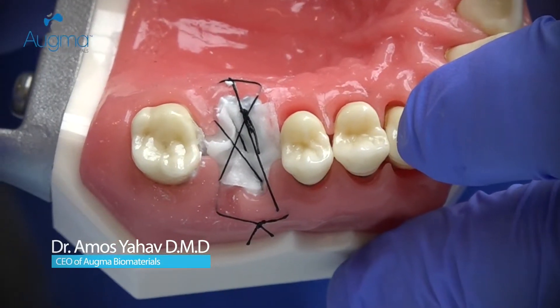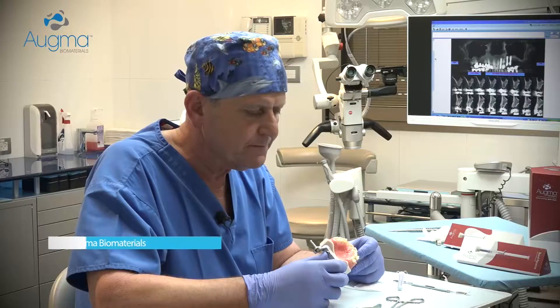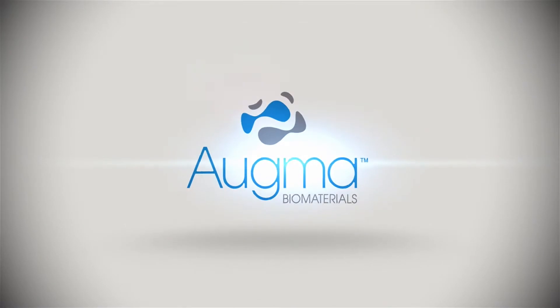Soft tissue will migrate above the graft and will close the area. That's all.